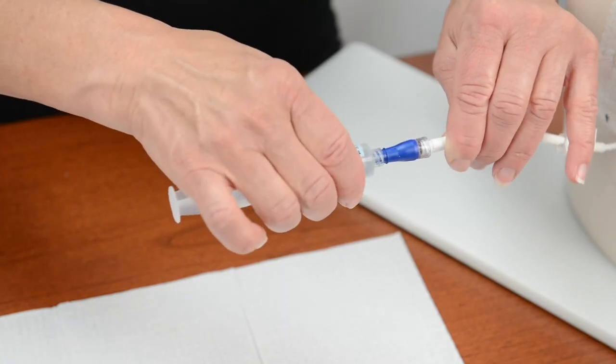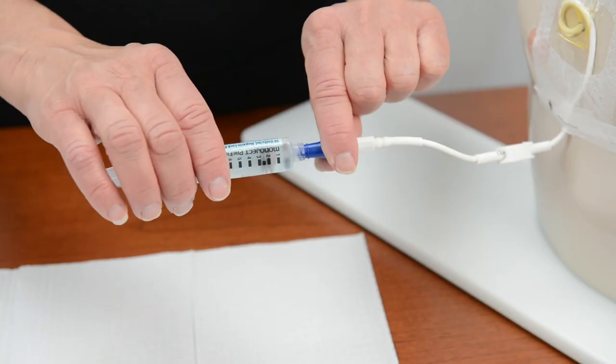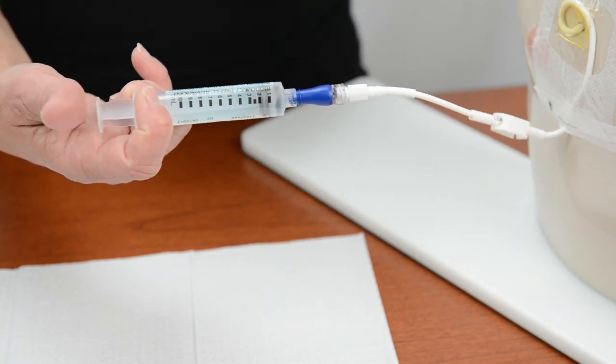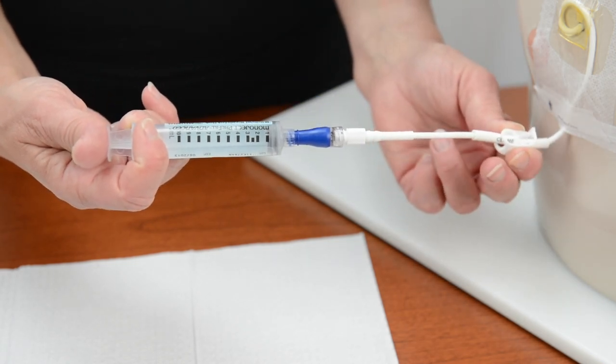Insert the needleless connector into the IV catheter and twist the syringe to tighten. Open the clamp on your child's IV catheter. Use the push-pause method to slowly push fluid from the syringe into the IV catheter. Then close the clamp on the IV catheter.